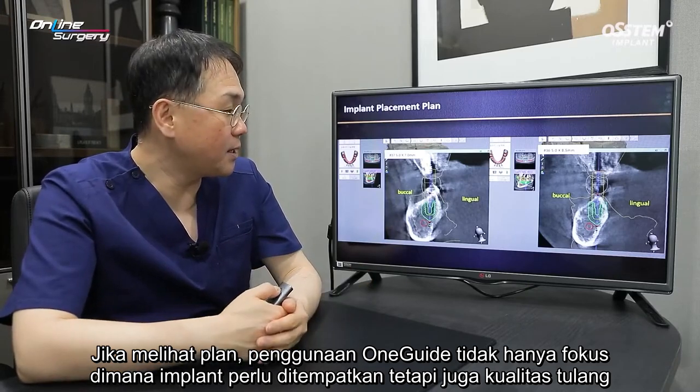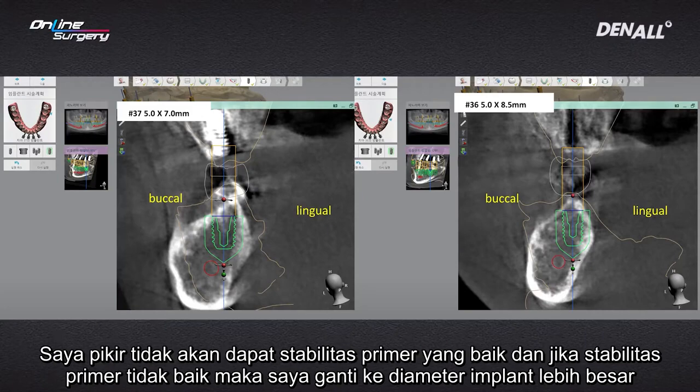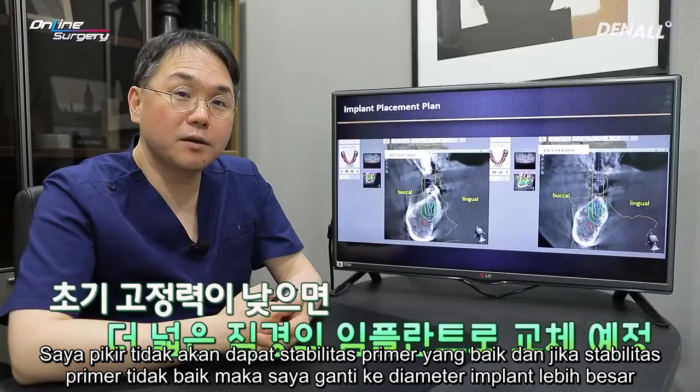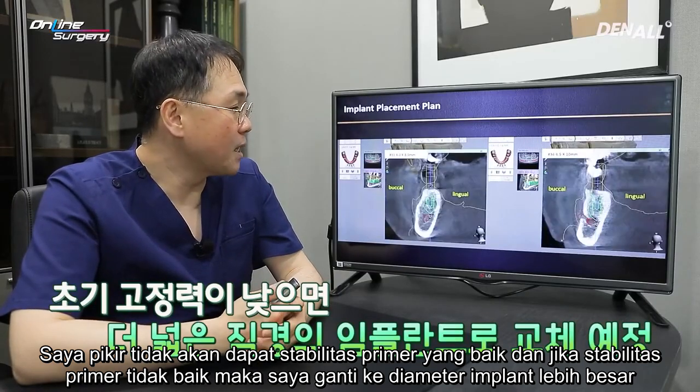on the bone quality as well. As shown in number 37, the crestocortical bone is very thin, and below, the cancellous bone's density is very unfavorable. I thought I would not be able to get good primary stability, and if primary stability is not good, I'm going to change to a bigger diameter implant.